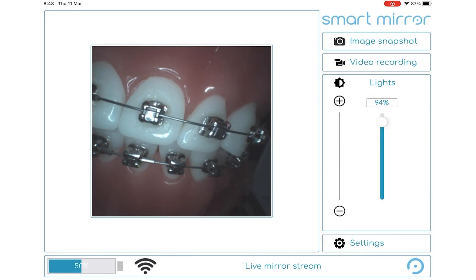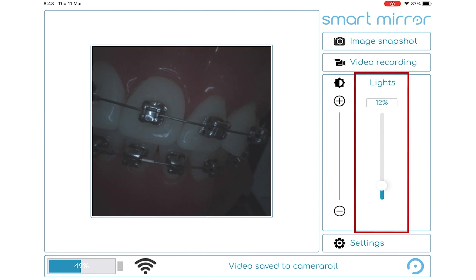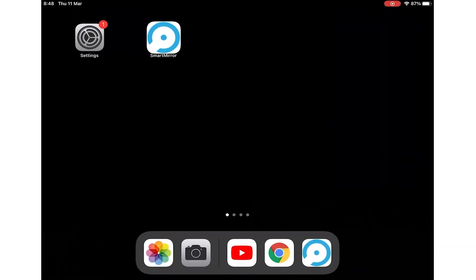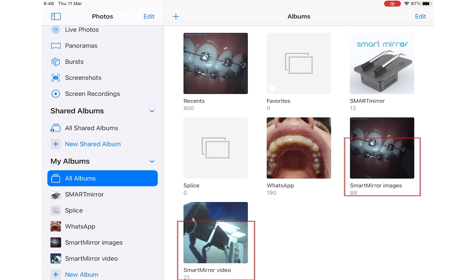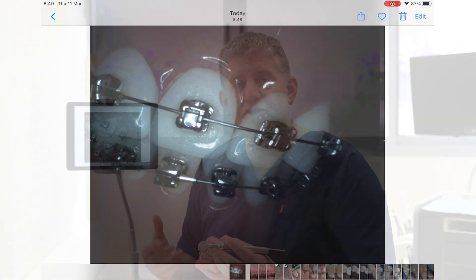I can take a video recording by pressing Start and then Stop. I can also adjust the intensity of the LED lighting. Images are stored on the photo library of your iPad in a special SmartMirror folder.